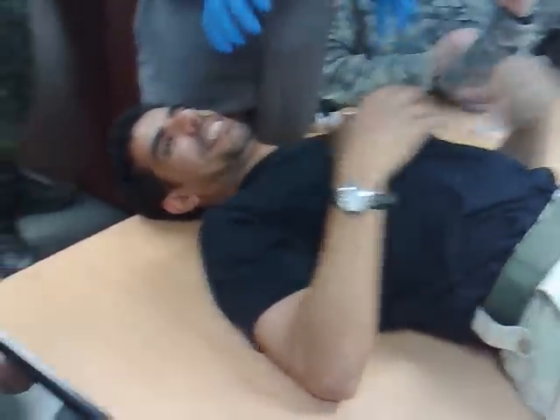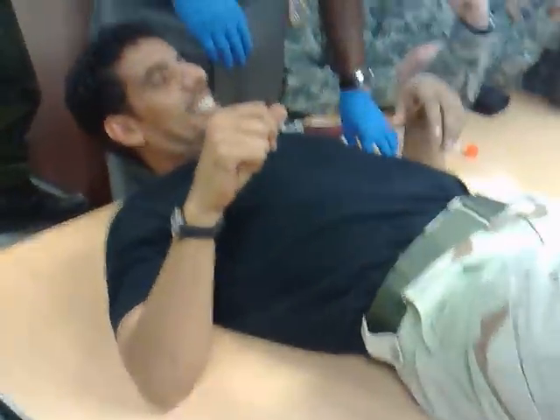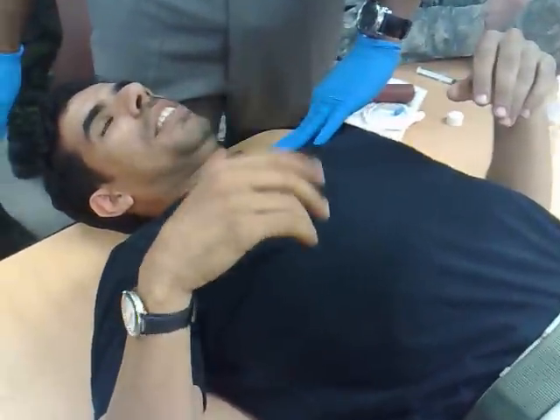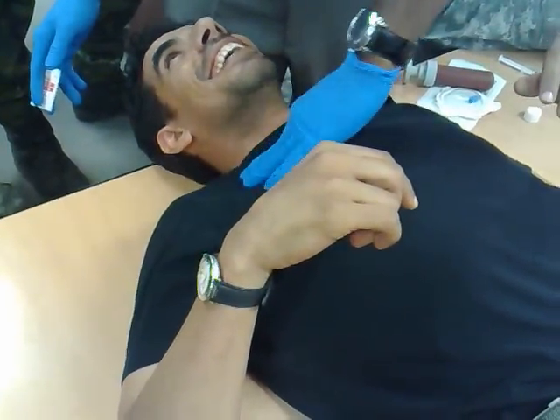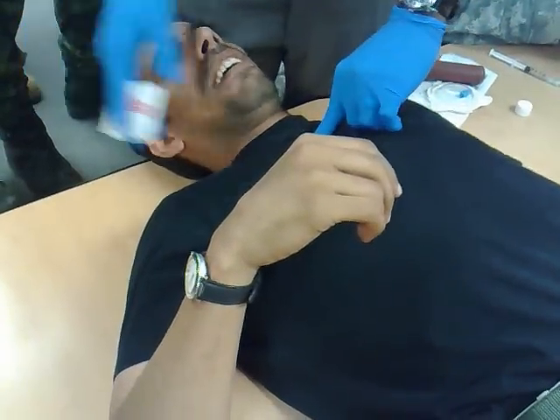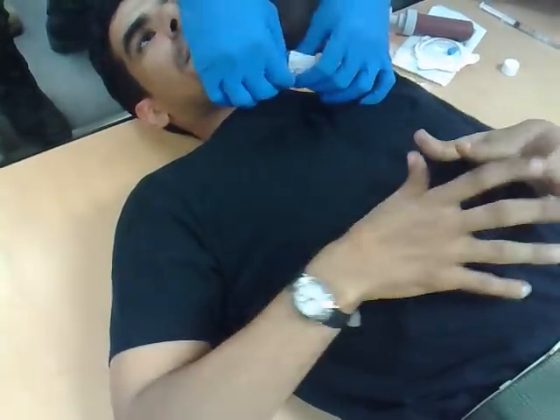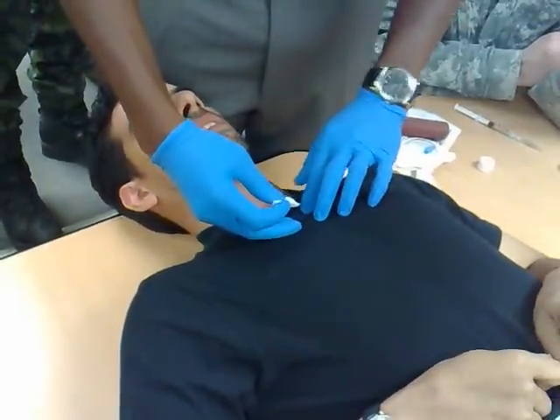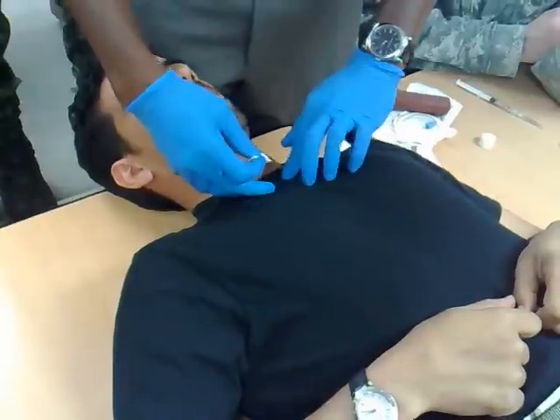Locating your suprasternal notch. Let me get the people in the front just to take a knee, because there's a lot of people that can't see. Guys up front, take a knee. You guys slide back. Relax — this is really gonna hurt. Alright, everybody can see over there. We're gonna want one afterwards. When you locate the suprasternal notch, you start at the top of the clavicle — you're gonna find this clavicle. Put your finger in the suprasternal notch. Rip your alcohol pad open. Since I'm going through the shirt, I'm gonna have to dab this over the shirt.